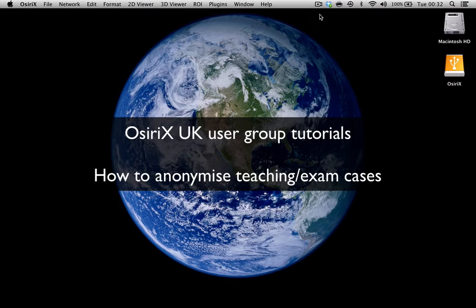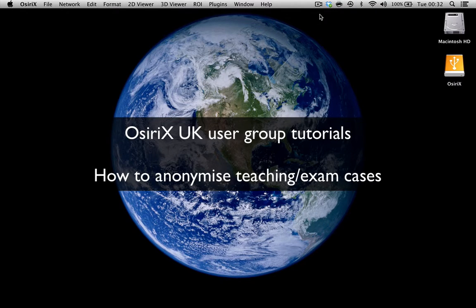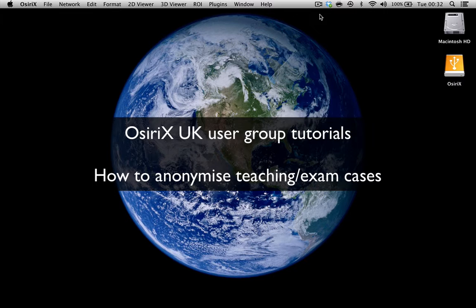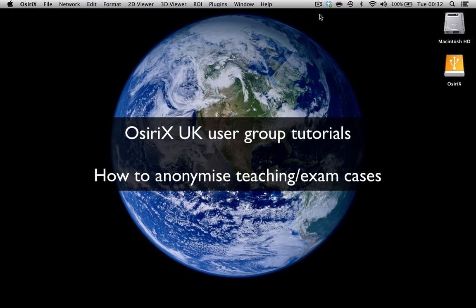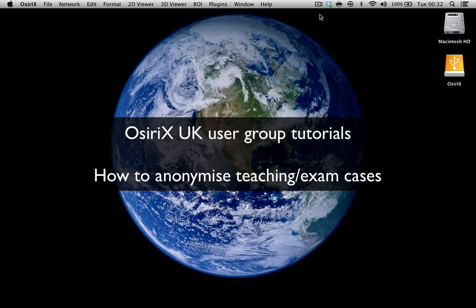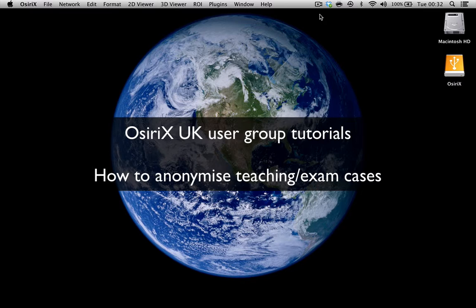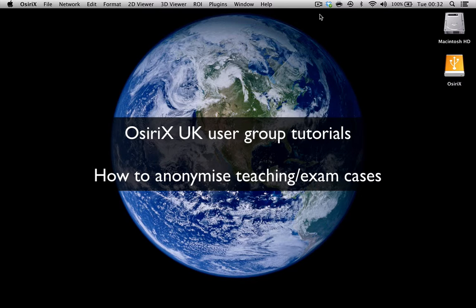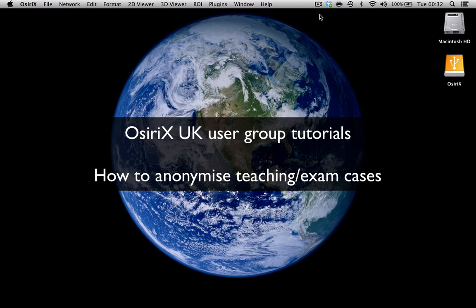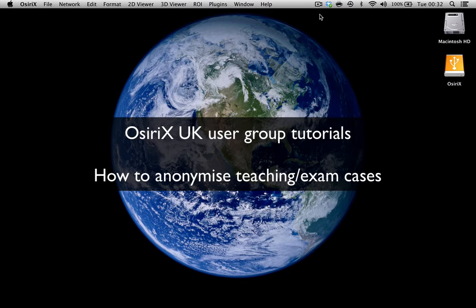Hello, my name is Mary Roddy. I'm a radiologist from Charing Cross Hospital in London and also a member of the OsiriX UK user group. What I'd like to talk to you about today is different methods that you can use to anonymize cases that you put onto your OsiriX database for teaching or for examining.